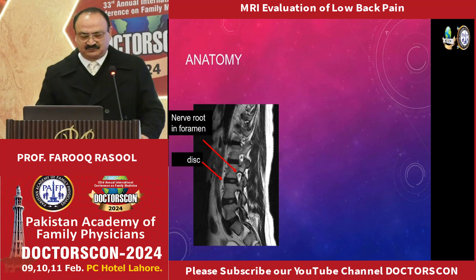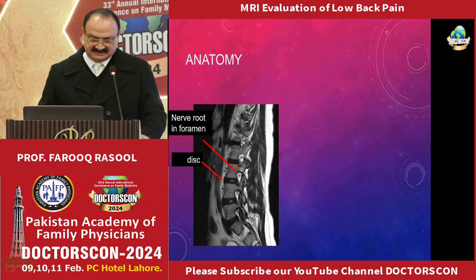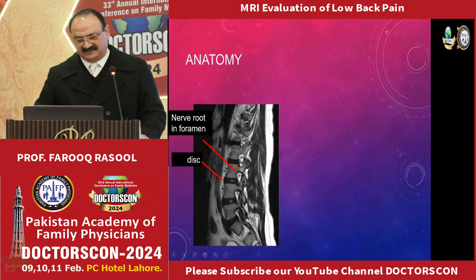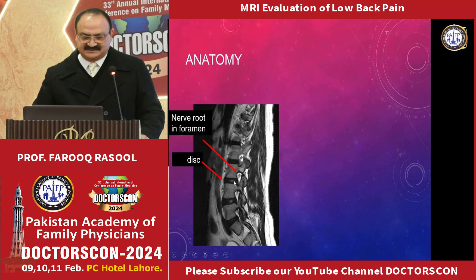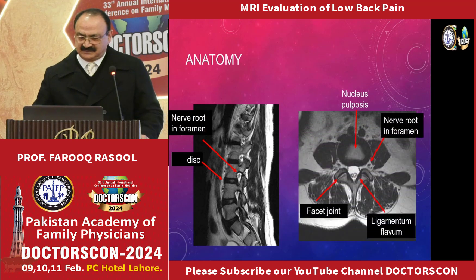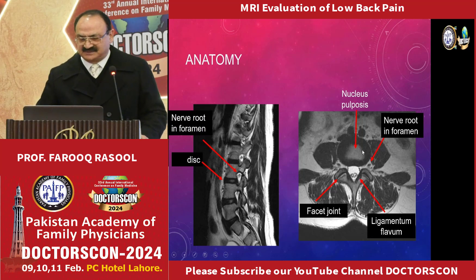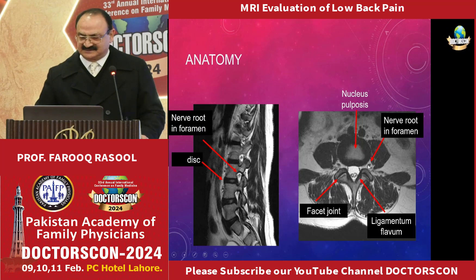We can see the nerve roots — they appear oval-shaped. In the center there is the exiting nerve, at the periphery you will find fat around the nerve, and vessels around the nerves. The disc is darker on T1-weighted image than the vertebral body. On the axial view, you can see the facet joint, disc space, nucleus pulposus, annulus fibrosus at the periphery, and the exiting nerves.